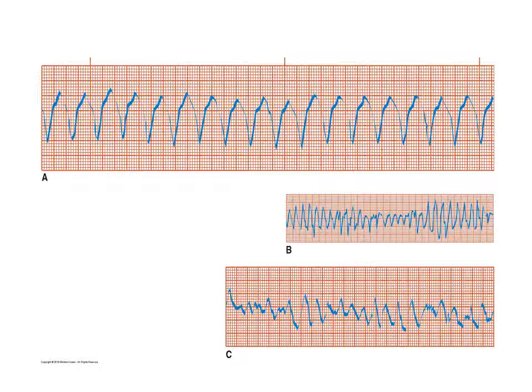I know that many of you think that this is a pulse VTAC and the others think pulseless VTAC, but how can you know that this is pulse or pulseless? For those who said pulse in their head, where did you put your hand on the computer to know it's pulse? To determine whether this VTAC is pulse or pulseless, you have to go back to the patient and palpate the carotid pulse.